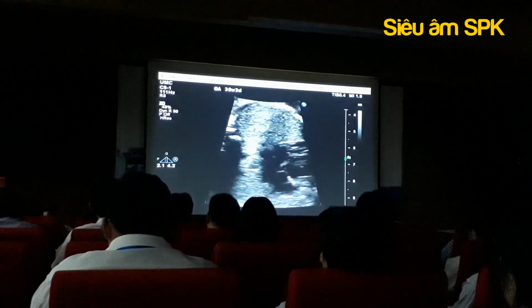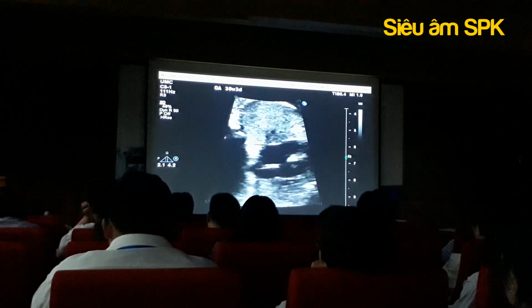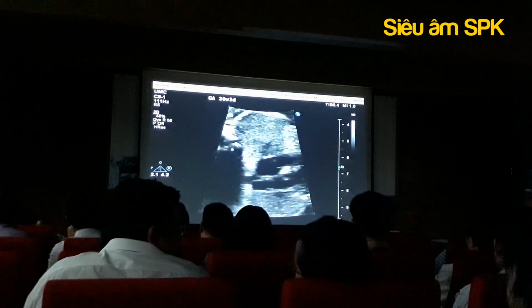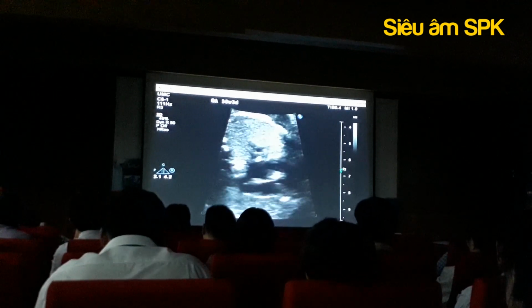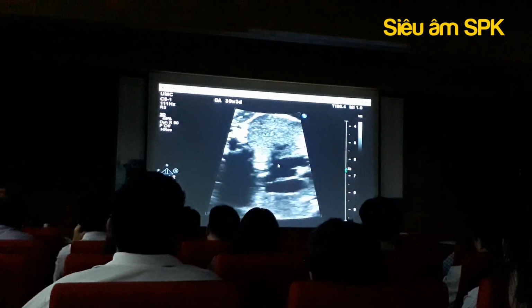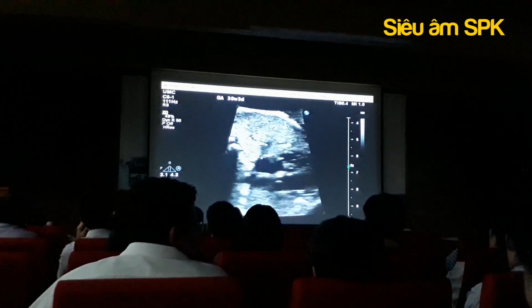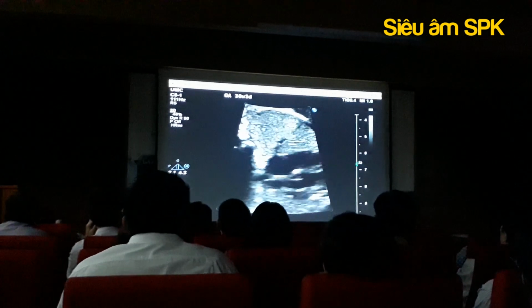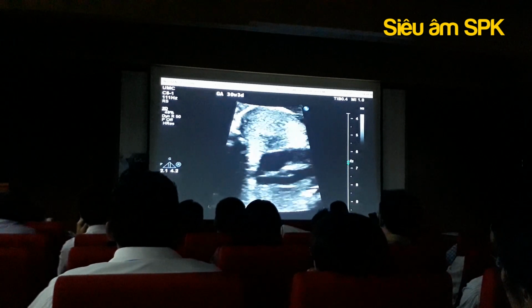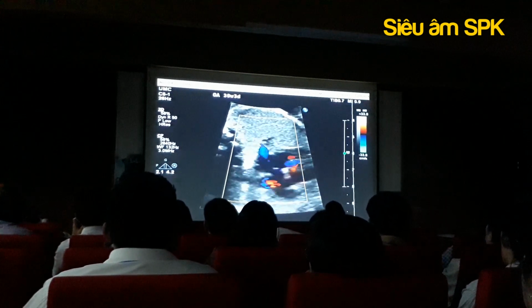Sorry to keep flipping things around. That's just the way that we scan. But we always have the landmarks of our spine here, and the apex of the heart is here. So now the left side is up. And so this is the left atrium closest to the descending aorta. And these should be pulmonary veins coming in from the hilum of the lung on the left side, and from the right side they should be here. Hopefully we'll demonstrate that with color.